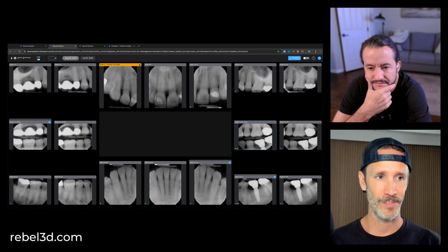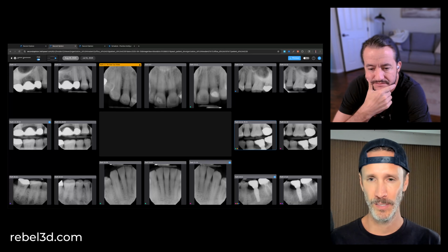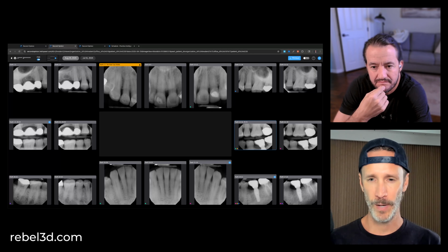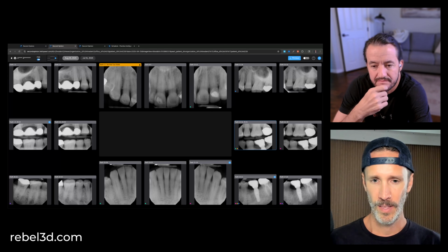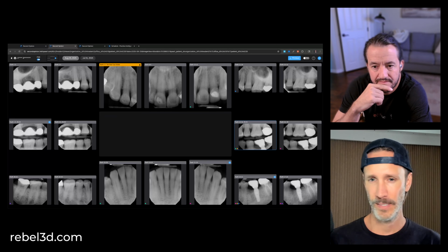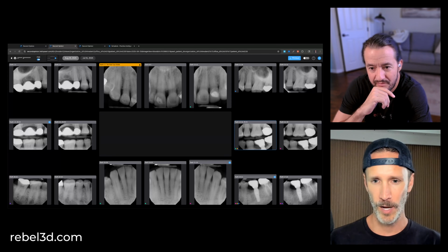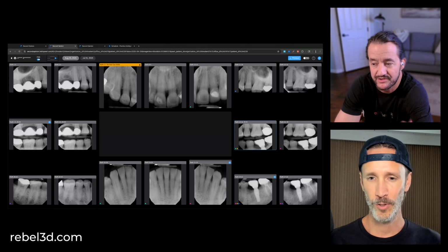I mean, this is not even just dentists, but humans that get so angry if there's a false positive or false negative that they just don't have the right mindset. And so it really takes the right mindset. You have to hold them accountable. I'm sure you use a lot of AI, just like large language models.